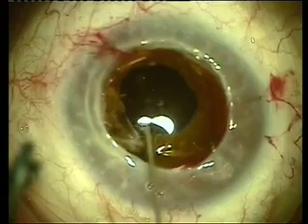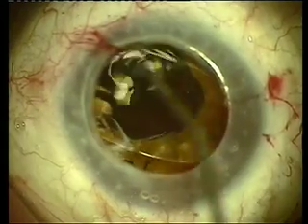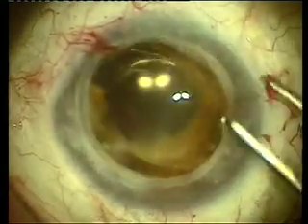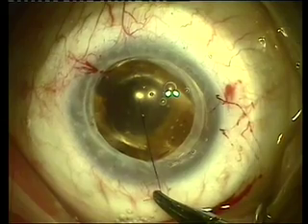The iris is pushed through the claws — the haptics of this lens — secure and replaced. This lens is well centered towards the geometric center of the pupil, and now the donor cornea that we had previously trephined is sutured into place.